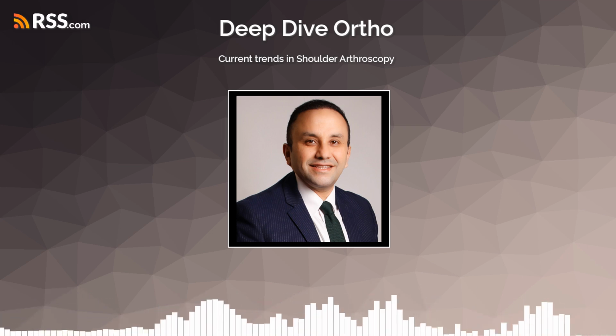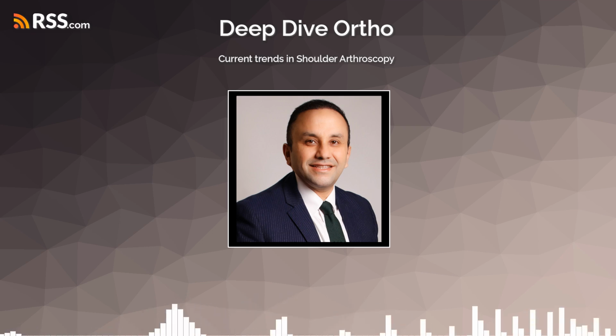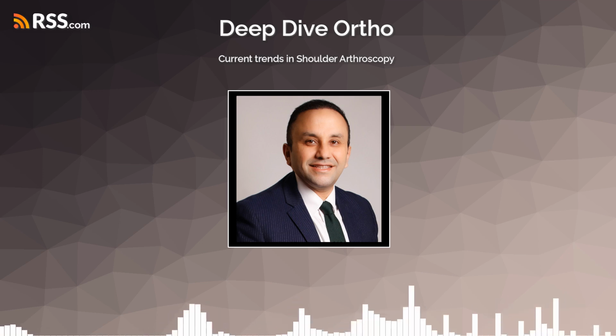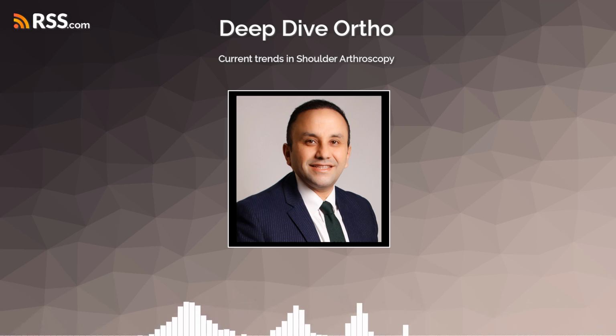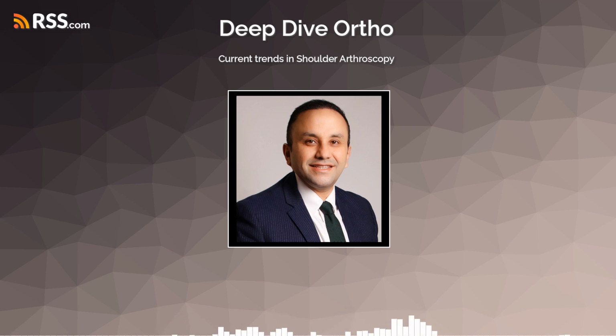Contraindications. Yes, there are certain contraindications that need to be carefully considered before proceeding, like active infection or severe joint destruction. Specific surgical techniques and portal placements are used to access the SC joint, and it requires specialized small instruments. What about instability? For SC joint instability, a specific arthroscopic technique has been described that aims to preserve the important fibrocartilaginous disc within the joint while using tendon grafts passed through bone tunnels to stabilize it.